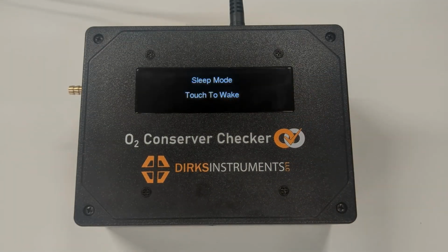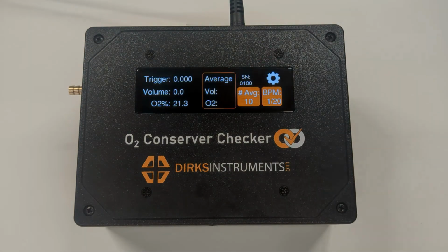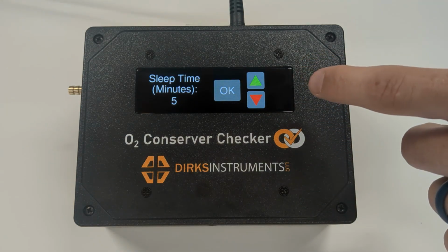Finally, we have the sleep time. After the device has gone a certain amount of time without being triggered, it will go into sleep mode. The sleep mode turns off the fan and prevents the screen from being updated. There will be a text on the screen that says it is in sleep mode, and you just need to touch the screen to wake it up. This value can be set anywhere from 1 minute up to 30 minutes.